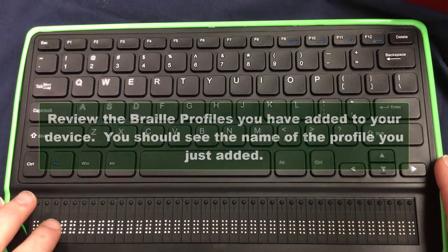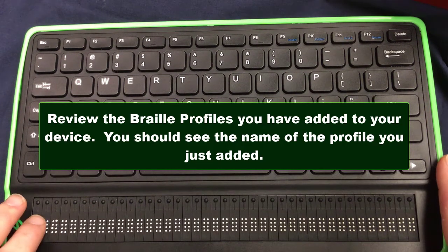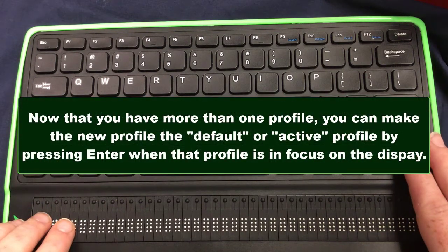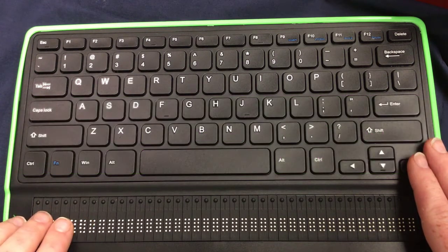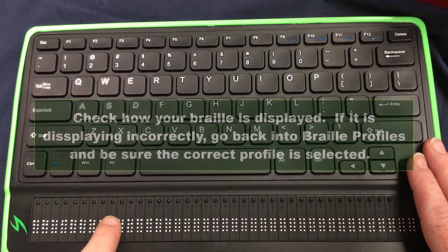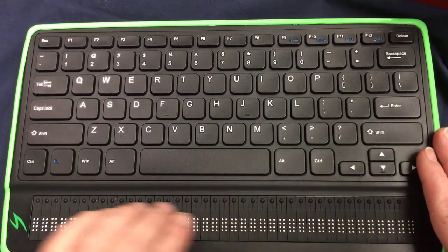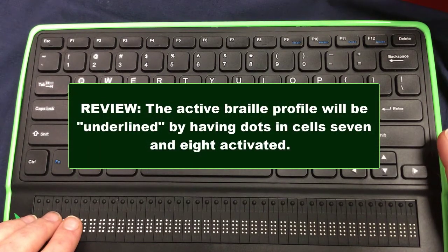But look — now I have 'test' showing up. That's the one we just created. If I want to make that the default, I could hit the cursor routing key or enter, and that would make it the default. Because I picked that braille grade of uncontracted, the display is now in uncontracted braille. But I can fix that — I can go into braille profiles, select contracted UEB, and press enter. Now it's underlined again as the active profile.